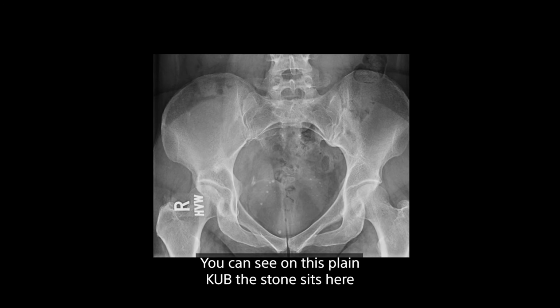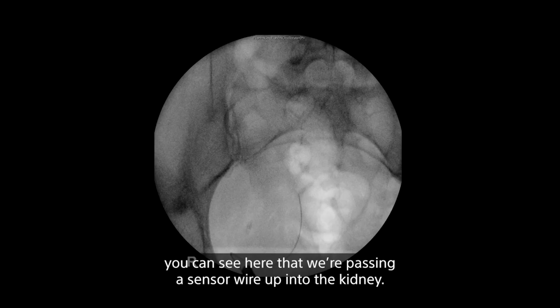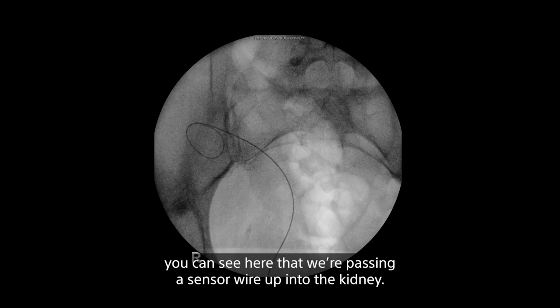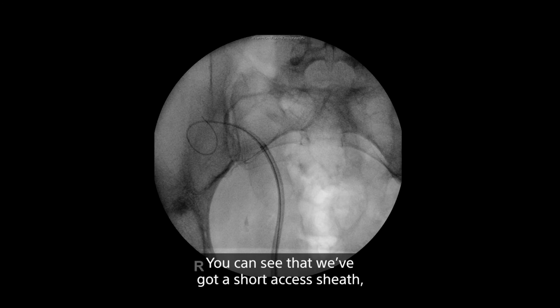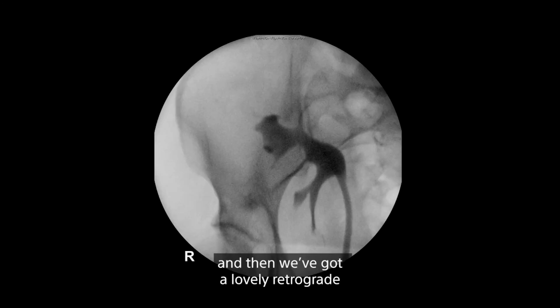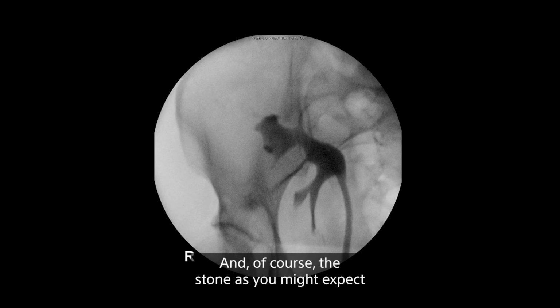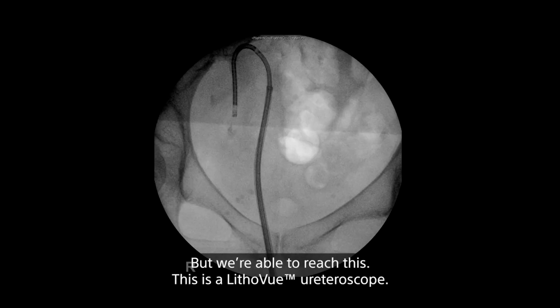You can see on this plain KUB, the stone sits here in the right iliac fossa, and you can see here that we're passing a sensor wire up into the kidney. You can see there we've got a short access sheath, a 28 centimeter access sheath, and then we've got a lovely retrograde which shows the transplant kidney in the right iliac fossa. And of course, the stone, as you might expect, is right in this most dependent calyx. But we're able to reach this.